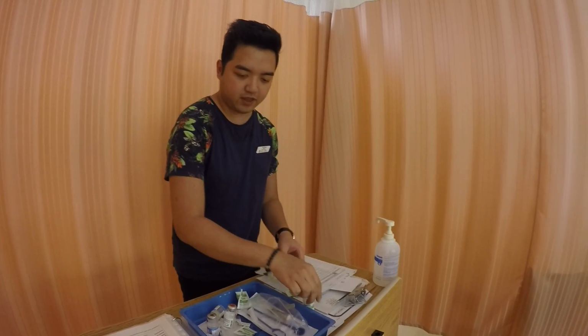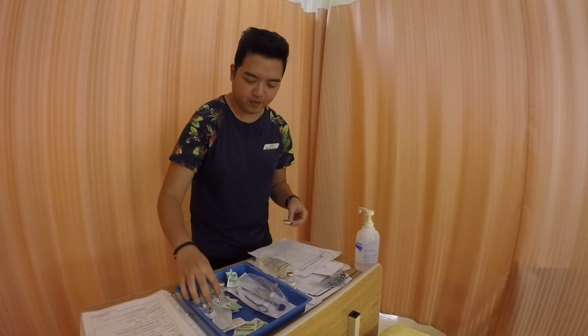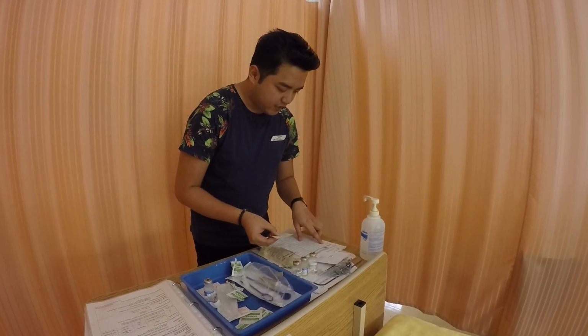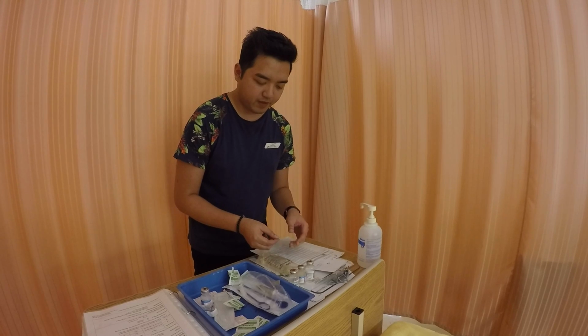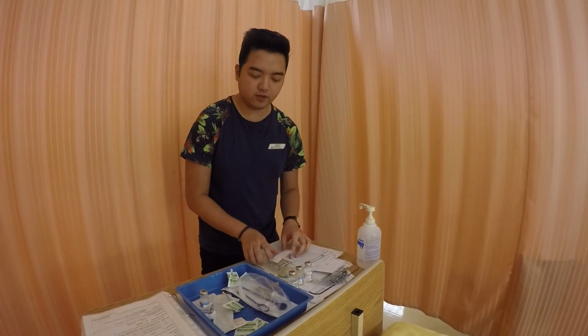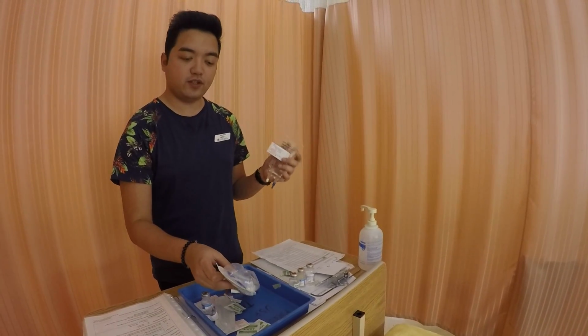Okay, there you go. And now this is what I call the 2.5 check, just to make sure that I have everything correct. So I have cefoxitin 1,500 milligrams for IV. The time is now and every 8 hours. And then this is for Miss Pamela De La Cruz. So I need to label the one in the IV so that other healthcare providers know what's inside the bag. Okay, and then now I'm ready to insert.